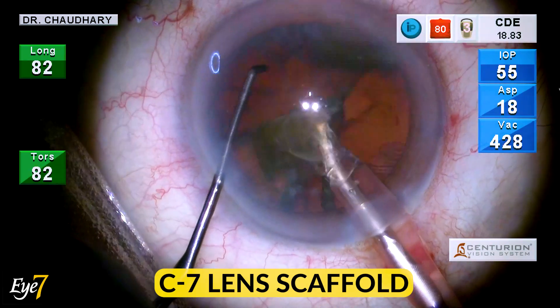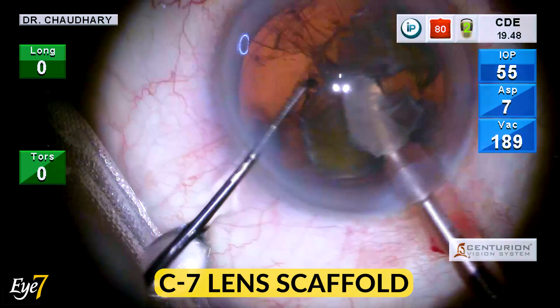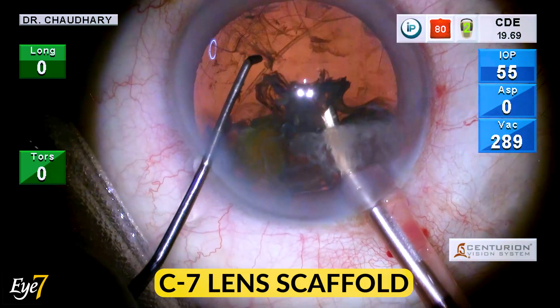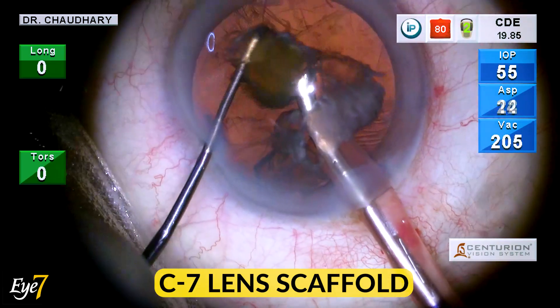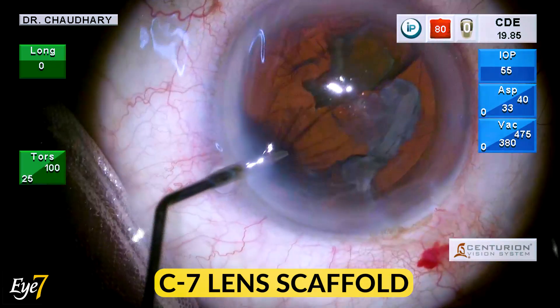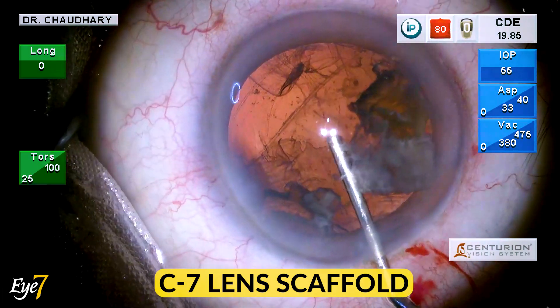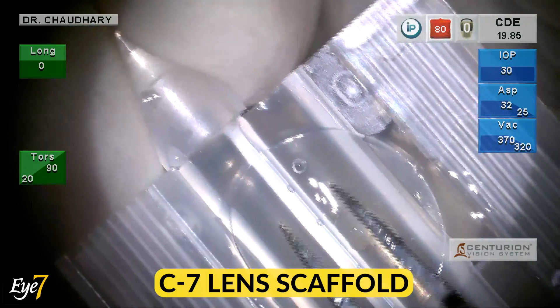A C7 lens scaffold is a very useful device in situations where there is a PCR with residual nuclear material. The chances of this nuclear material dropping into the vitreous is very high, and an anterior segment surgeon is always worried about this eventuality, because then he would need the help of a vitreous retina specialist. Here we have what is called a C7 lens scaffold.